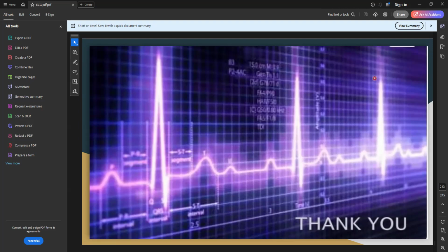So whether that can be kept in the posterior side and taken? Yes, no problem. Okay, so all the 6 plus 3 extra should be added? No, normally we don't require. But in case of posterior wall STEMI, ST segment elevation is seen in the posterior leads, that is V7, V8, V9.